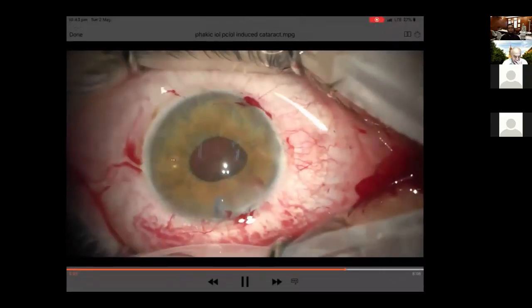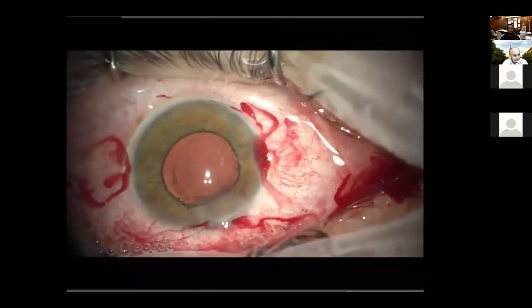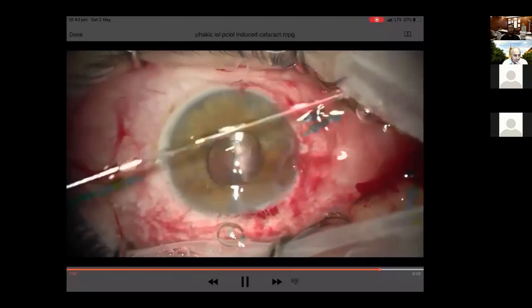And then we remove the cortical material, and finally implanting my intraocular lens and cleaning up the residual viscoelastic. Thank you.